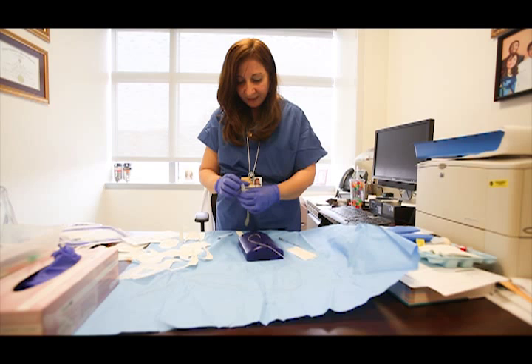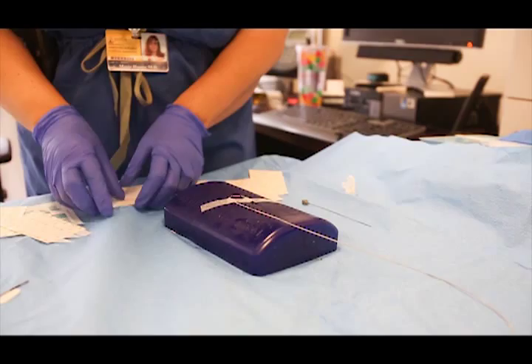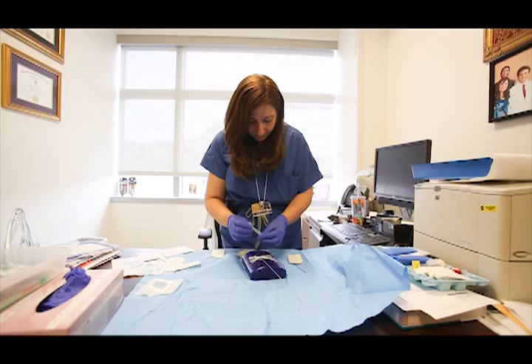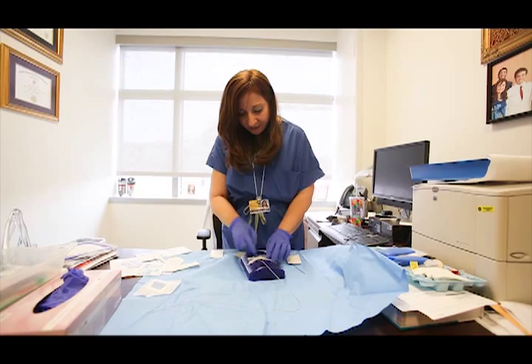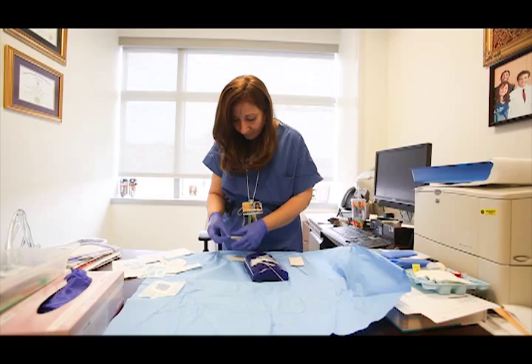A third way: after you spray Benzoin, put a lot of steri-strips, basically without hiding where the catheter is touching the skin — again so APS knows where the catheter is. This is how you apply all the steri-strips. As long as you can see the catheter insertion to the skin, this is the best way to secure a catheter without losing the view of the catheter insertion. Then put a Tegaderm on top.